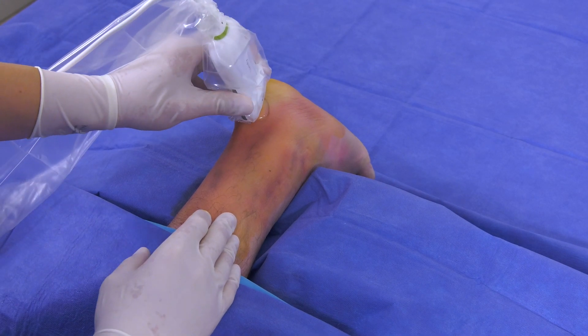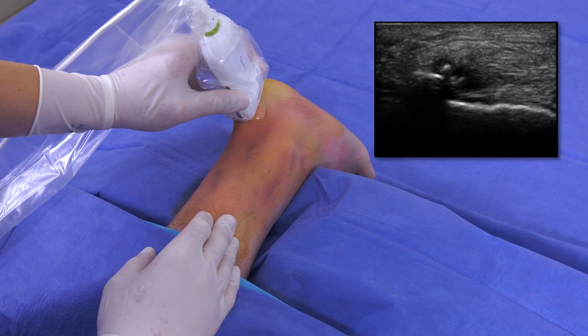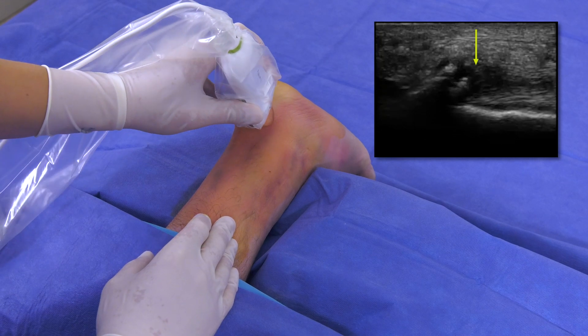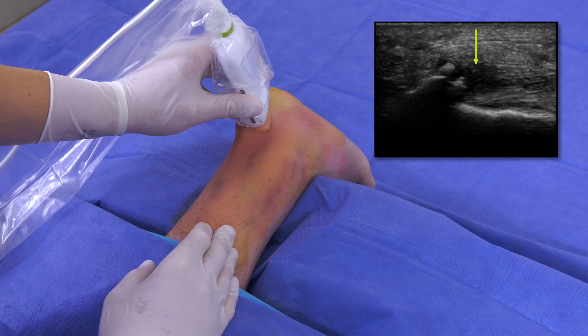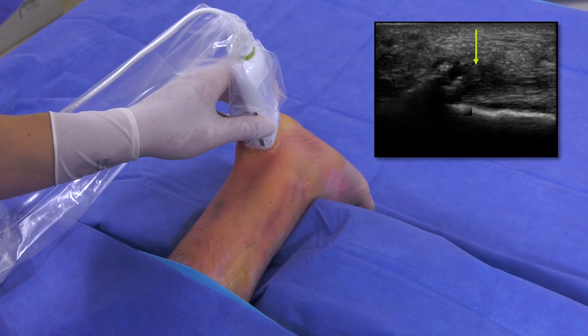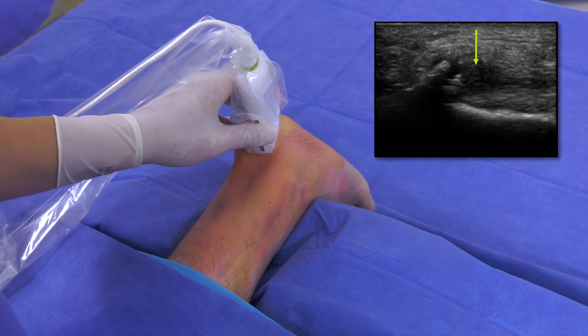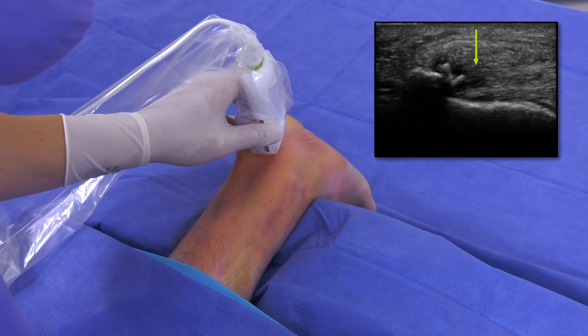As I scan the tendon with the ultrasound I can visualize the pathology, which appears as black or hypoechoic on the ultrasound device. As you can see, this patient has a black or hypoechoic area on the inferior portion of the Achilles where it attaches onto the calcaneus.